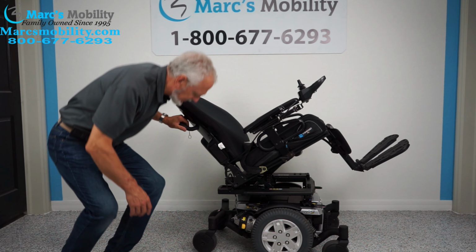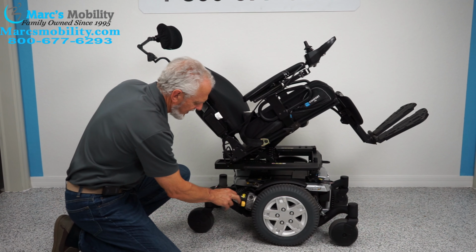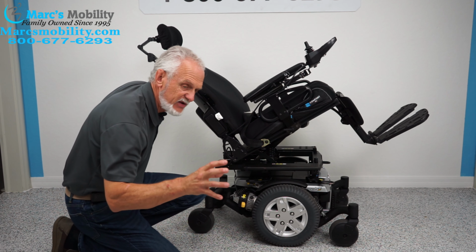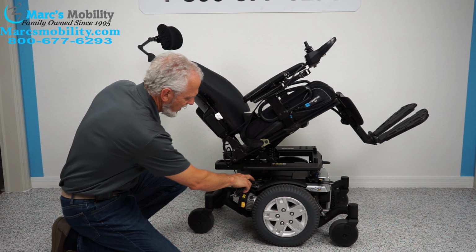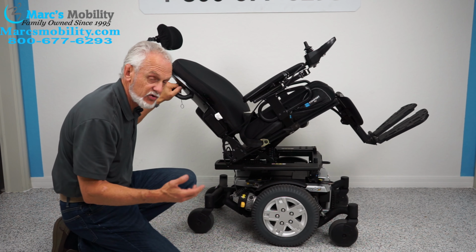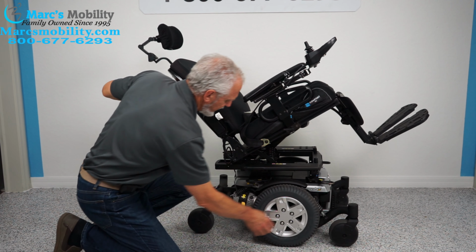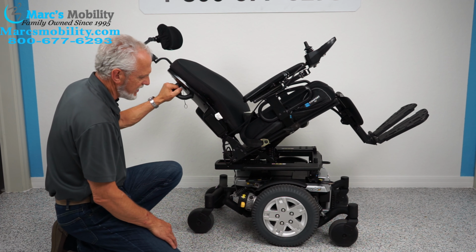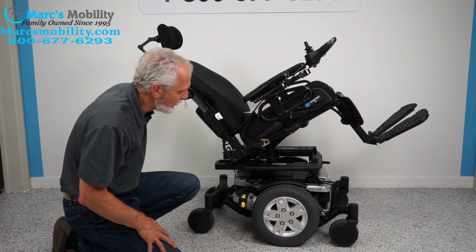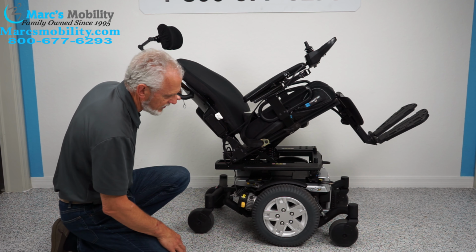Let's look at the base while we have it tilted. You have 14-inch wheels. You have the HD motors. These are heavy-duty motors. They have 4 poles, 4 brushes all the way around, so they're going to be a little bit noisier because they're a little bit heavier duty, okay? You have an anchor point here, an anchor point here. This is where you would secure your chair to your lift or to your van if you're going to transport it, okay? You also have the rear suspension here. The same suspension in the front. You have 4 of these shocks around this chair, okay? This chair weighs about, I would say probably in the 350 to 375 weight capability, so it's a pretty heavy chair, okay? So this is built for a heavy person, okay?